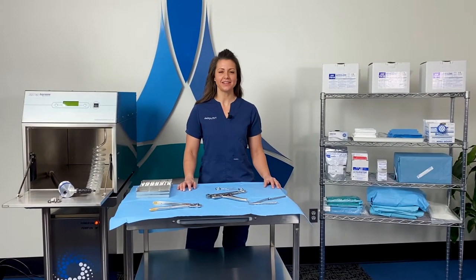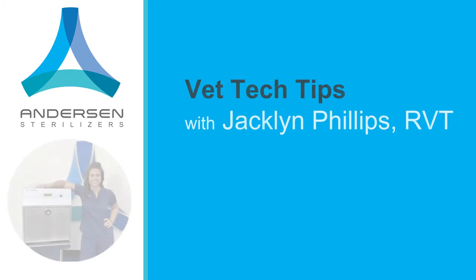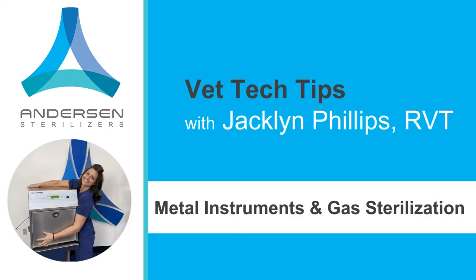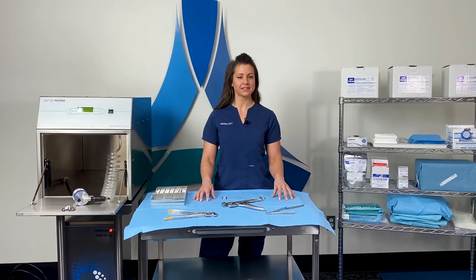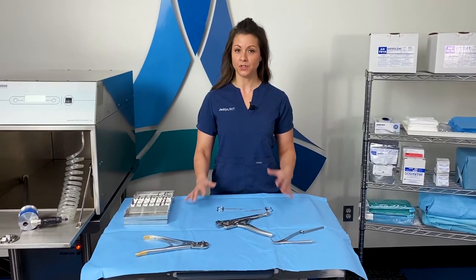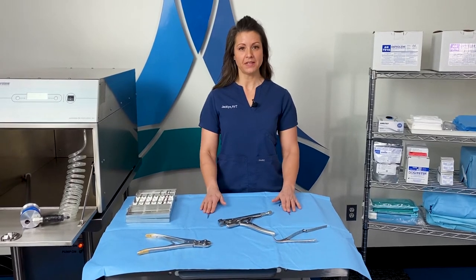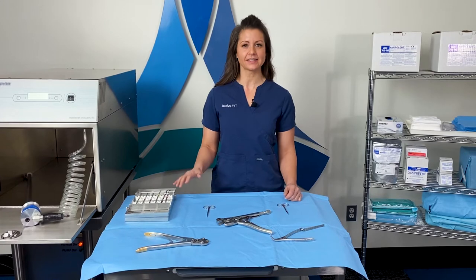Today's tech tip is regarding why we would use EO gas for metal instruments. So something like orthopedic packs that have sharps like saws and pins, you need sharp scissors. That would be something to preserve your instruments utilizing EO gas.